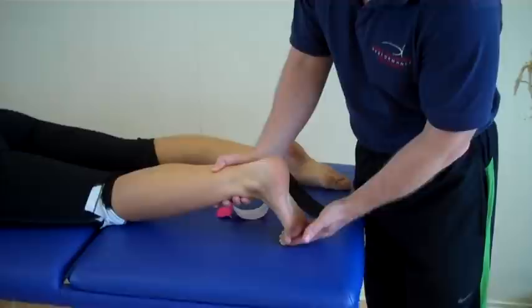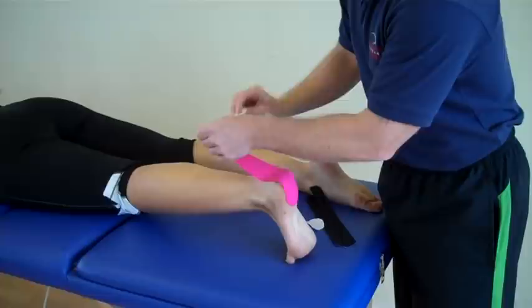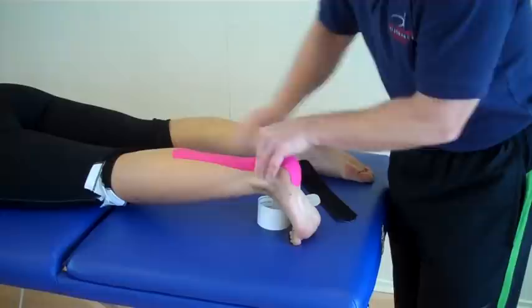For the first bit of tape, the Achilles is going to be on stretch to start with — that's our starting point. Then no stretch on the initiation of the tape, and we can literally apply that onto the calcaneus with no stretch. Because the tissue is already on stretch, we're literally going to feed that out, coming down like so, and then just warm that up.